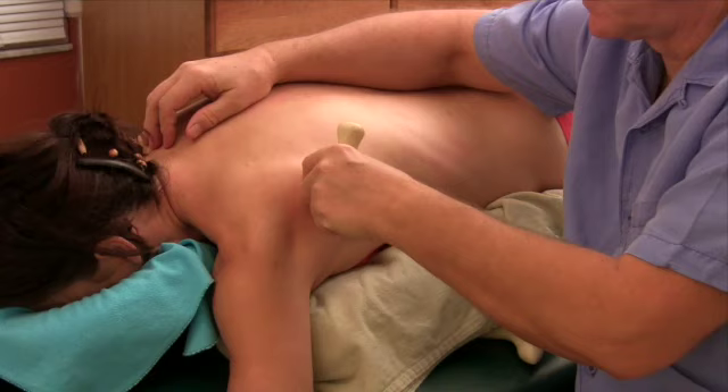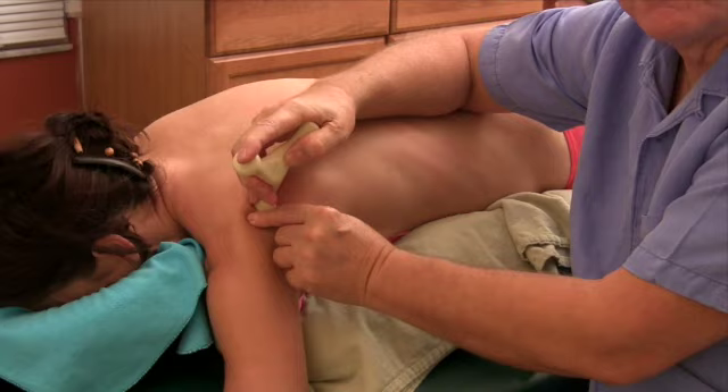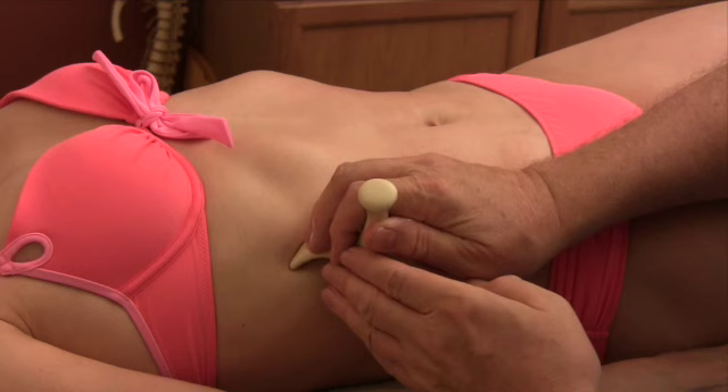Each of the tools has gone through a fair bit of metamorphosis over the years as I improve each tool by using it in my clinic — noticing how I could make the tool a little more comfortable for my hands, or how I could shape the tool a little bit different so it would be more effective, or adding extra tips. It's my goal to have as many as six working edges on each tool, so you don't have to buy as many tools and don't have to be constantly setting them down and picking them up.